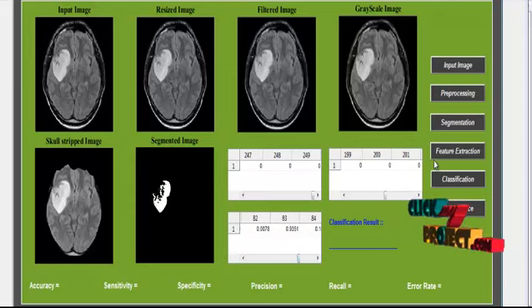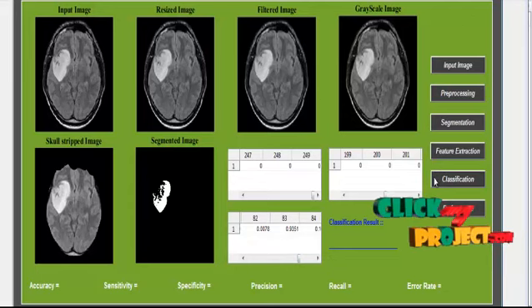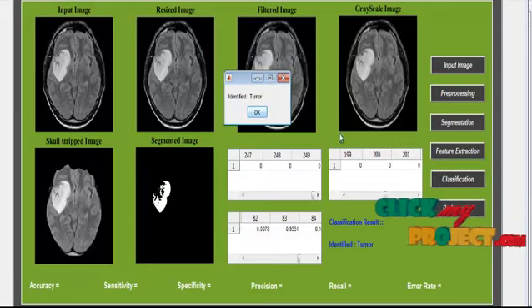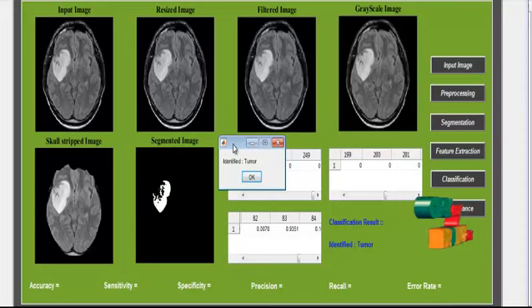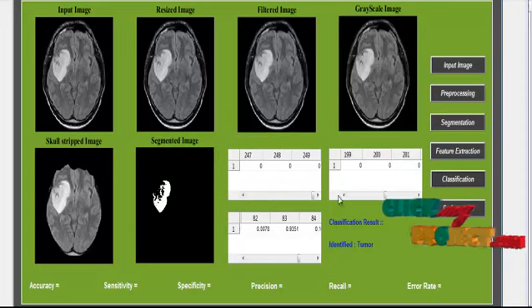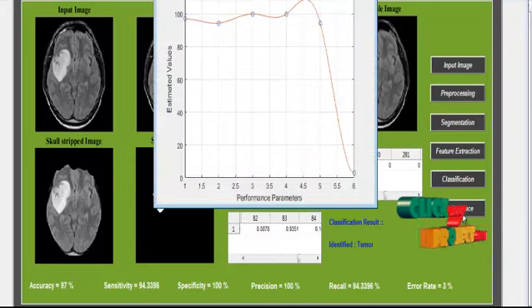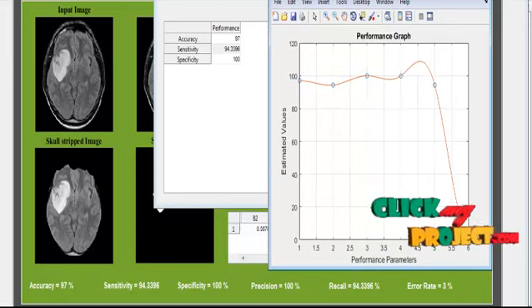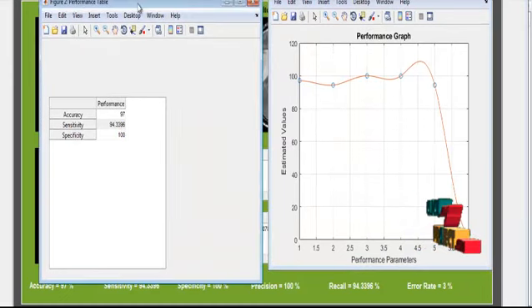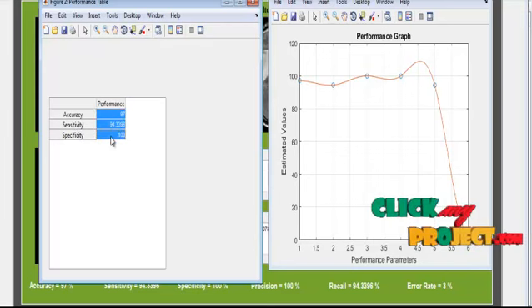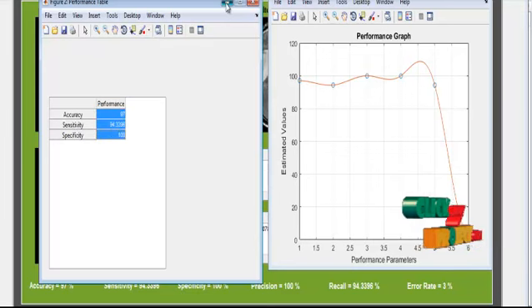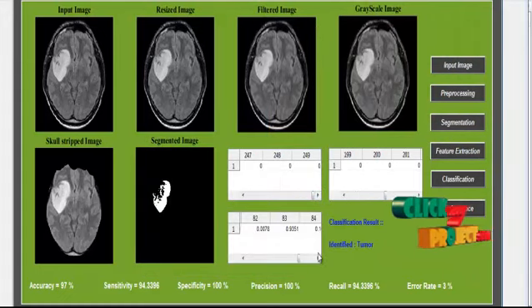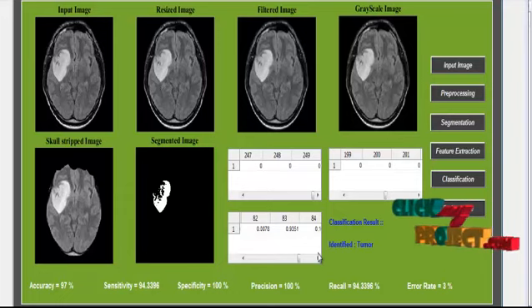After extracting the features from the image, we move to the classification step. In this classification step, it classifies whether the tumor is present or not. If it is a tumor image, it will show a message box displaying Identified as Tumor. After classification, we move to performance estimation, where we find performance metrics like accuracy, sensitivity, and specificity, shown in a table as well as in bar chart format. Additionally, precision, recall, and error rate are also calculated.